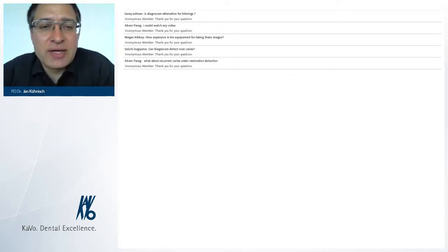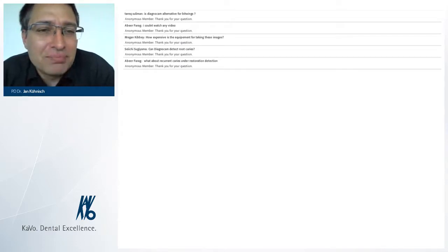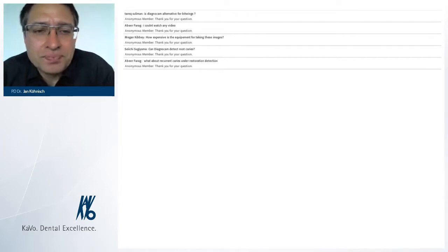The question is, can Diagnocam detect root caries? I think no. As I'm working with children, I'm not so experienced in elderly patients, but from my understanding of the technology, it must be stated that root caries is located deeper or much deeper below the coronal part of the crown.